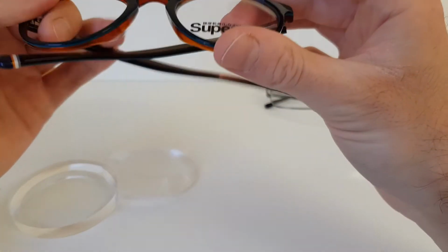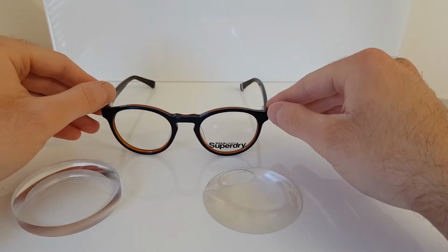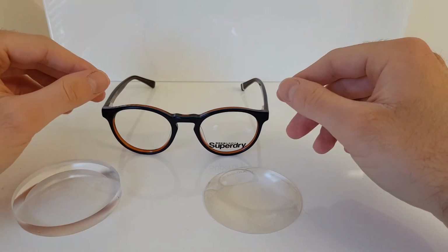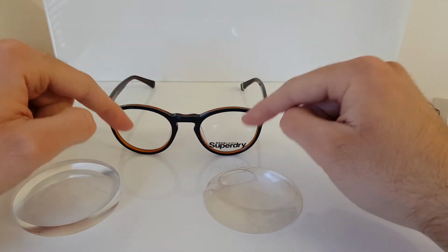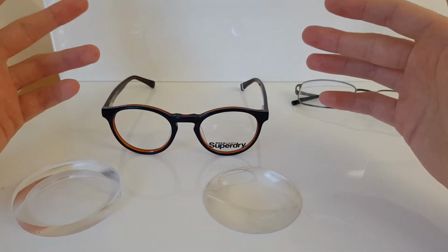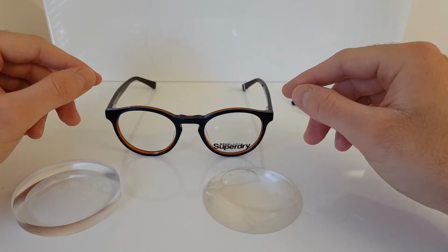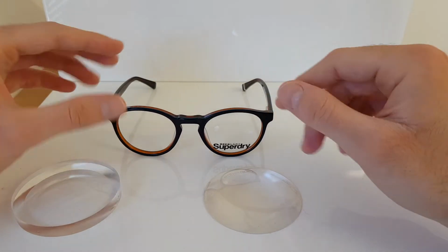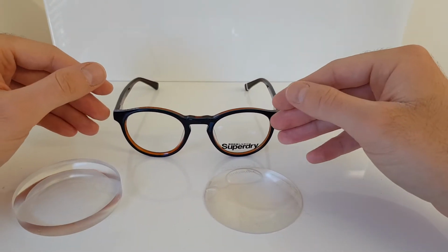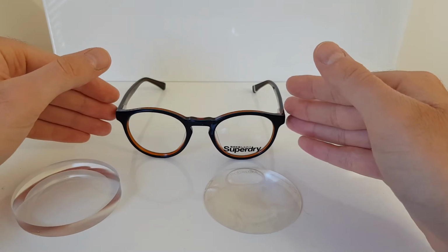The next thing you can do is pick a suitable frame if you've got a high prescription. Now, if you go for a really large frame, obviously the bigger the frame and the bigger the lens shape, the more lens is going to be in that frame. That's obviously going to make it heavier, and it can also make the lenses thicker. What you want to look at is getting a frame which is more suited to the dimensions of your own face. So what I mean by that is you want to try and get a frame which is suited for you.